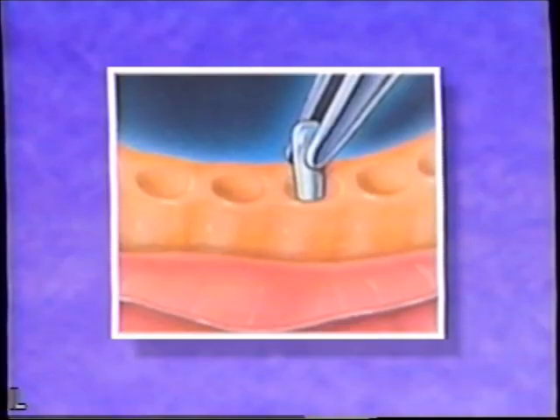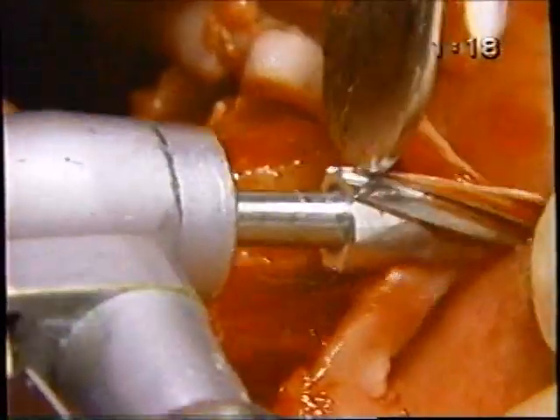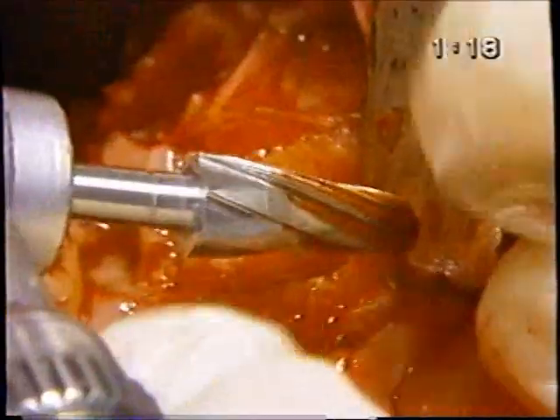And with the patient that we were working with today, we only placed 2. We'd like to put it in the canine area, but in the process of bone smoothing in order to get primary closure, which we have to have over these, so much bone was lost, thin, prominent bone in that area, that we can't use that particular socket.